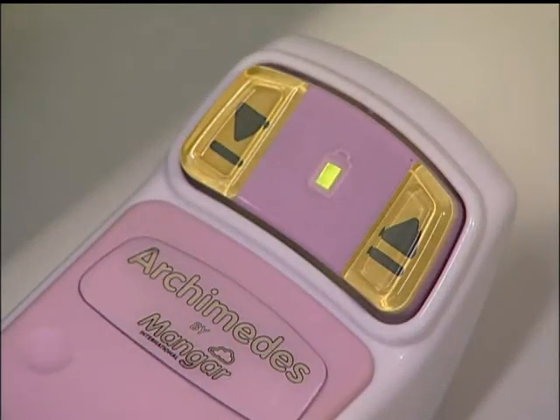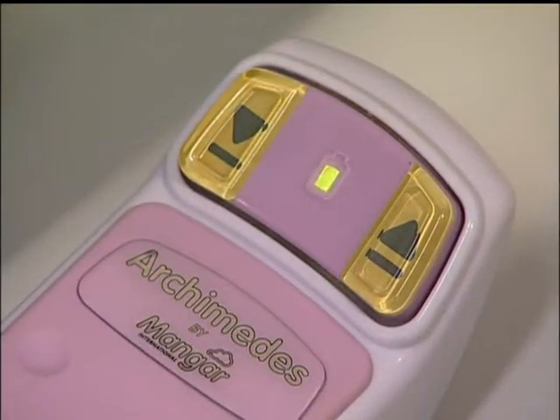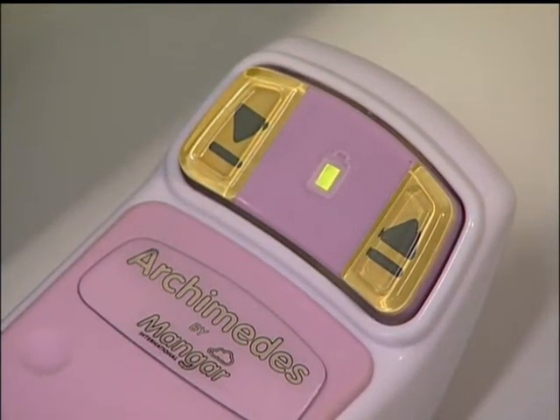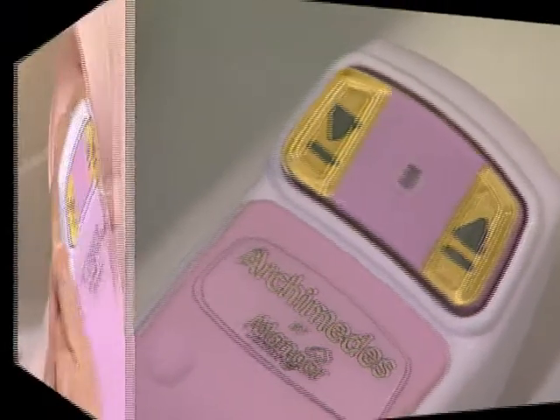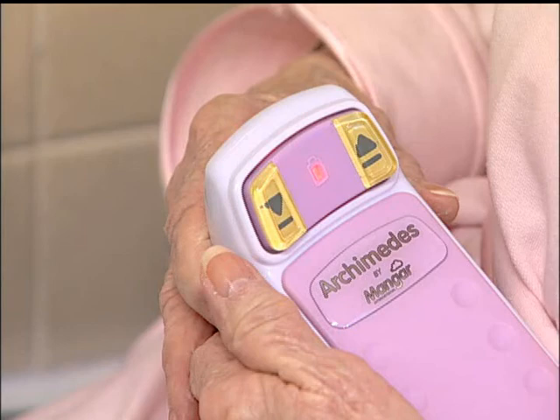If the light on the hand control is solid green, the unit is fully charged. If the light is blinking green, the bath lift may be used but should be recharged before the next use. If the light on the hand control is red, do not attempt to use the bath lift.